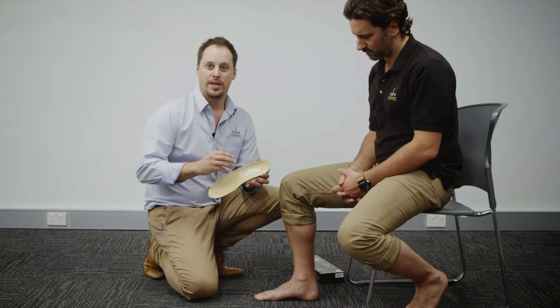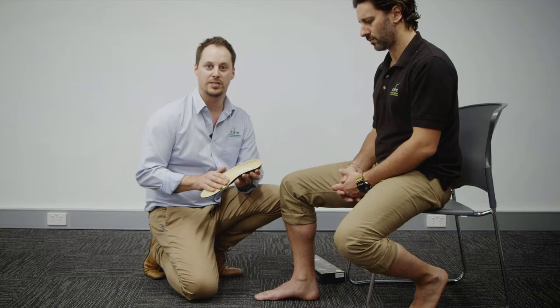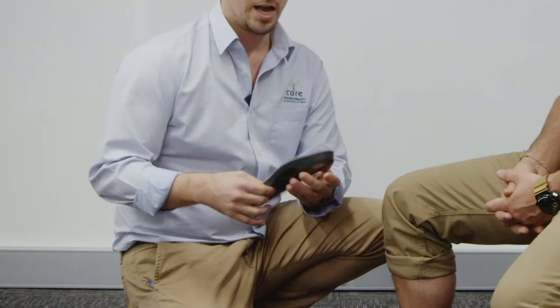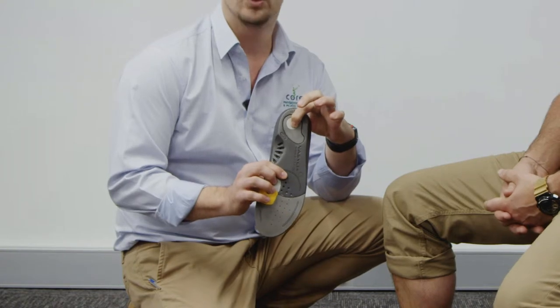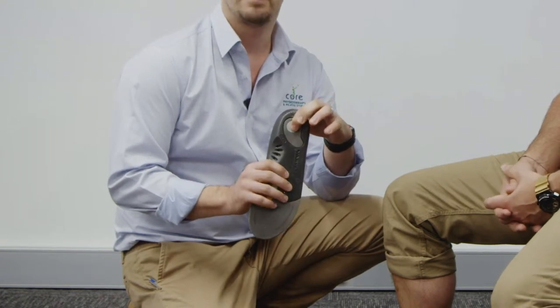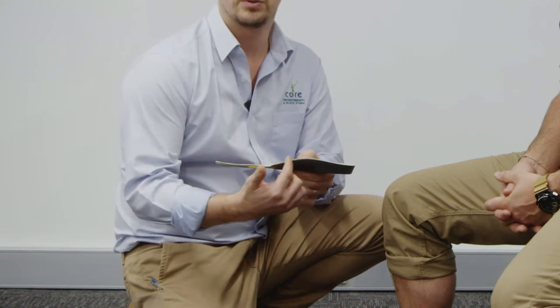The top of the orthotic has a nice comfortable felt layer on top, which allows the foot to sit on it without slipping and sliding when you're wearing socks. It has a nice heel cushion in the back that works well for people with heel pain, and it has a great medial arch support through here as well.